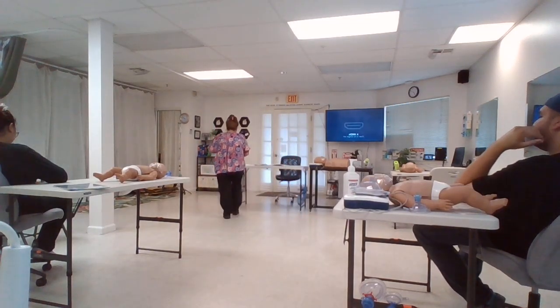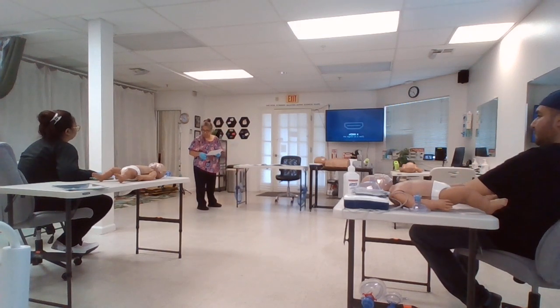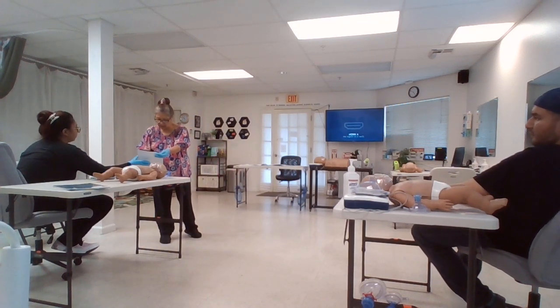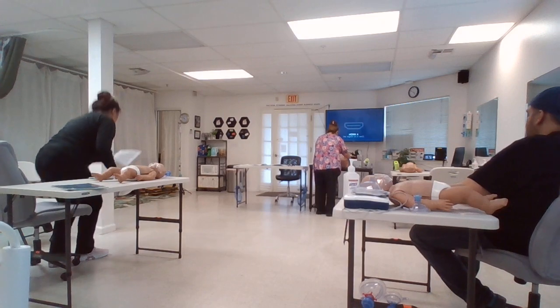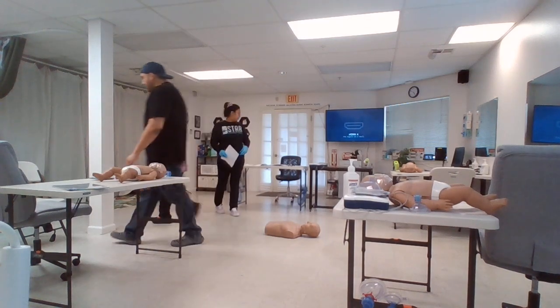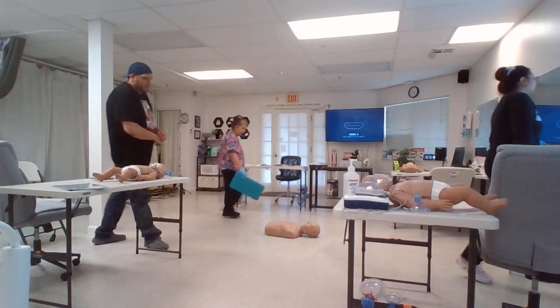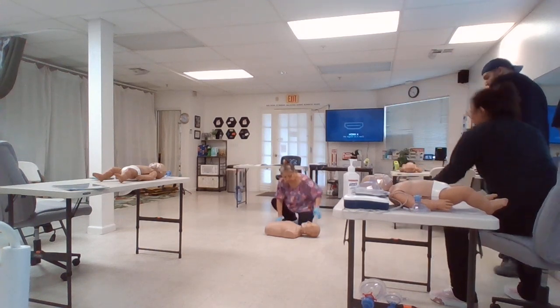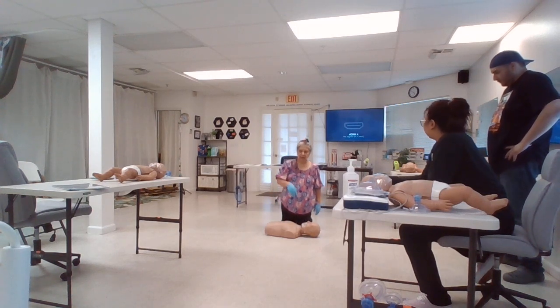Now, going to the scenario. If I did not have people that I know, I have to do it myself. How many cycles? Make sure that this is working. Do you have battery?